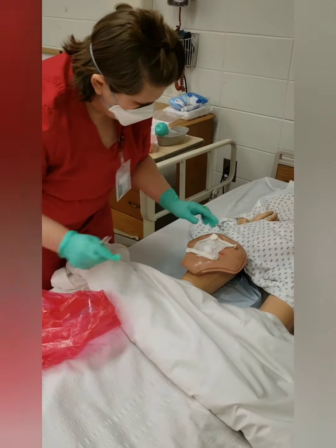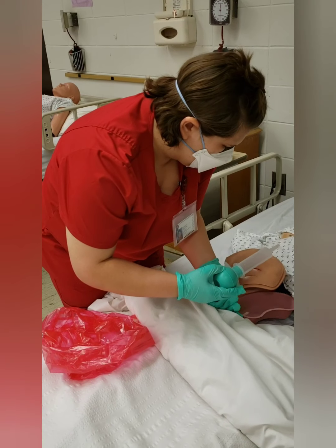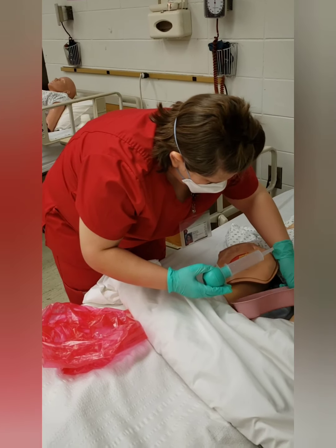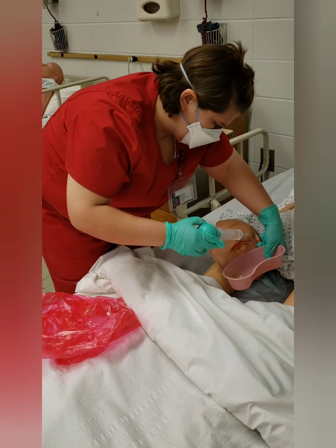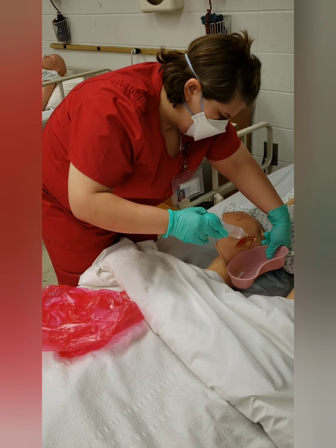I am now going to wash my hands and put on new gloves. We are now going to get some sterile water and irrigate the wound. We're going to use this basin to catch the sterile water draining off the wound. We ensure that we do not let this touch the inside of the patient's wound. We just get close enough just to clean the wound.